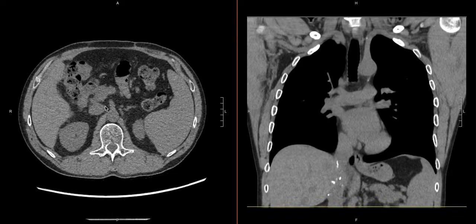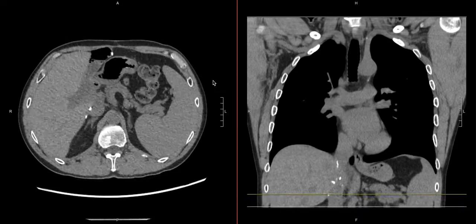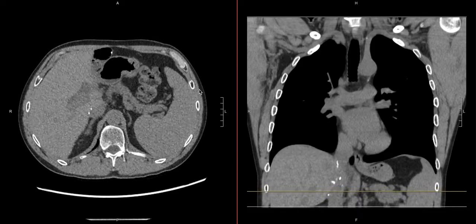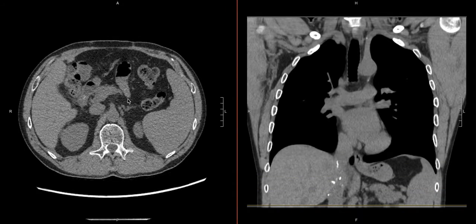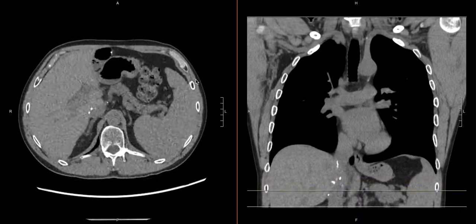Now, the other thing to keep in mind is even though we can't necessarily trace the whole GI tract, at this point, it can be a good opportunity to scan through the upper abdomen and just see if there's other pathology that you're interested in or that kind of grabs you. You may just see, here's some scattered small bowel. This looks like large bowel. You just want to make sure that there's not anything crazy going on.